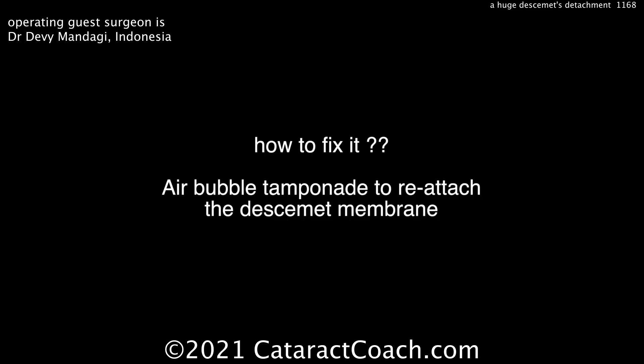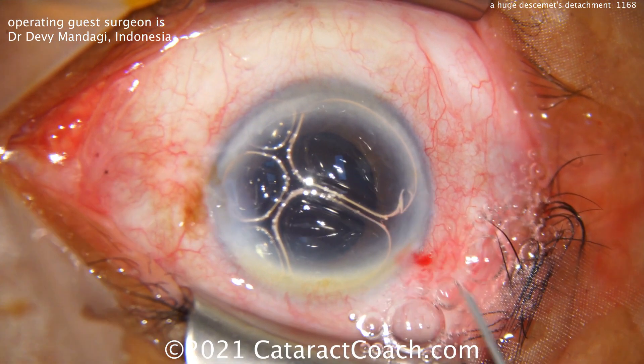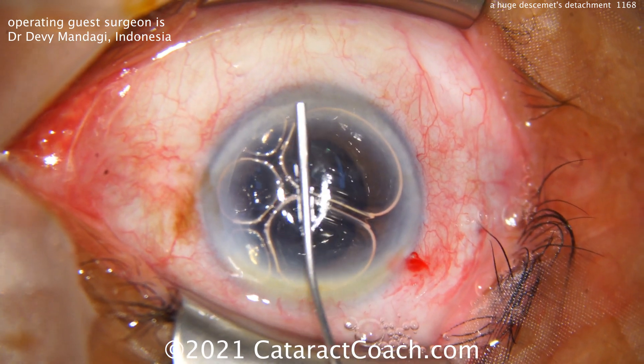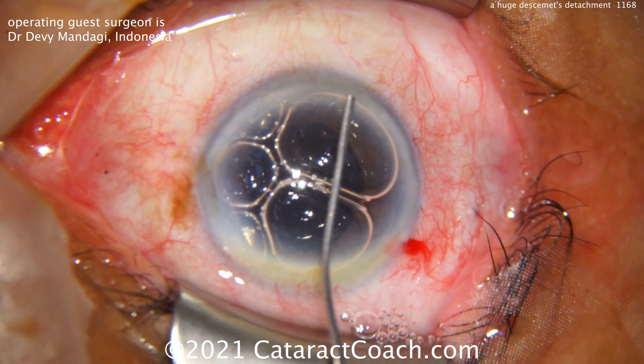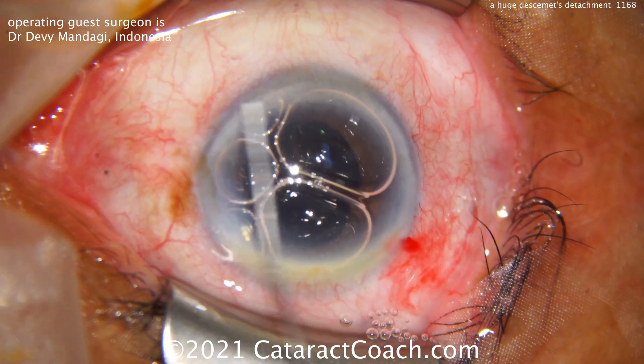So how do you fix it? A bubble to help tamponade. This is just an air bubble of regular gas, and that can go inside the eye. That's just room air that's filtered, and that'll hold it in place. You let that heal up, and the patient should do okay.